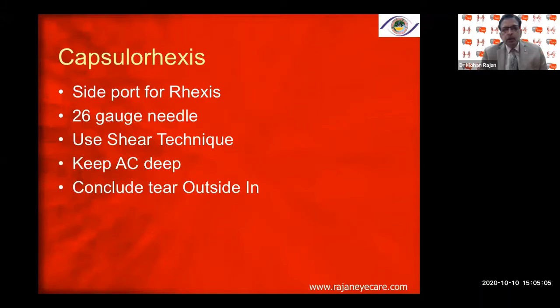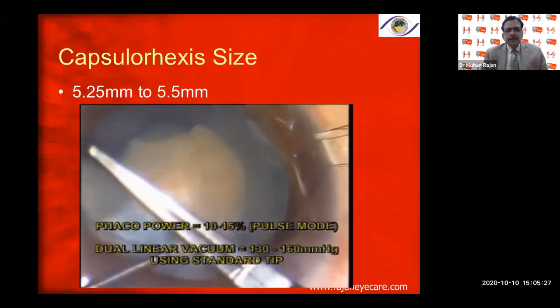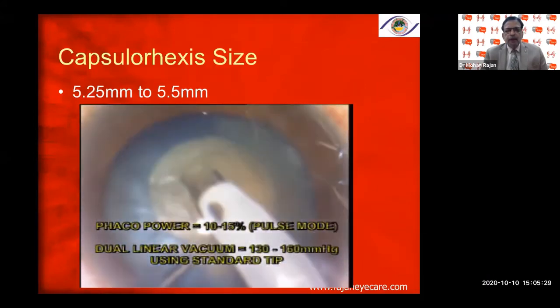Entry through a side port is always better because chamber stability is better. Use a 26-gauge needle or a 27-gauge needle. Use a shearing technique, keep the anterior chamber deep, and conclude the tear from outside in. Aim for a capsular rhexis of about 5.25 to 5.5 millimeters.